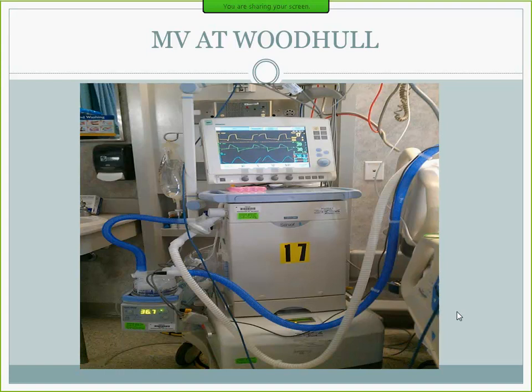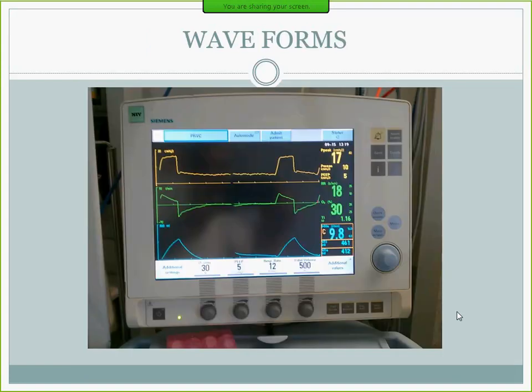There shouldn't be any leak in the whole system. You can actually look at all the numbers on the side here, and your inspiratory volume should be the same as expiratory volume. These are the waveforms that you will frequently see on the machine. This is your pressure that is required to achieve whatever tidal volume you have. This patient is on volume control right now, so every breath is the same tidal volume. But we will go through that.